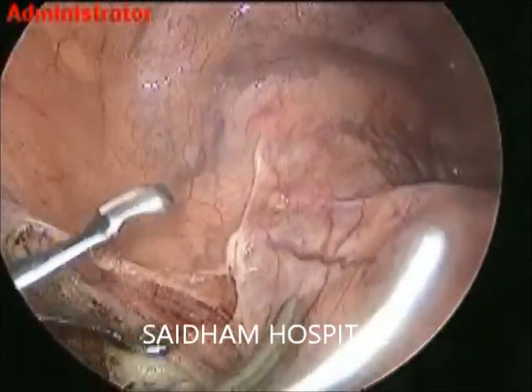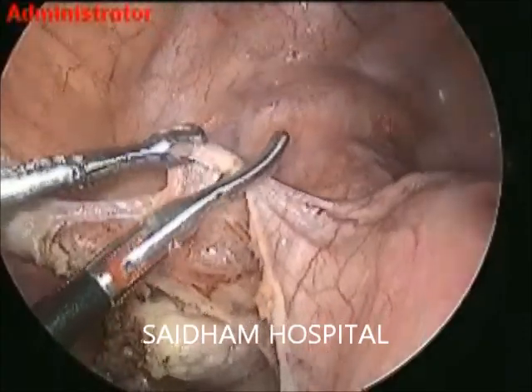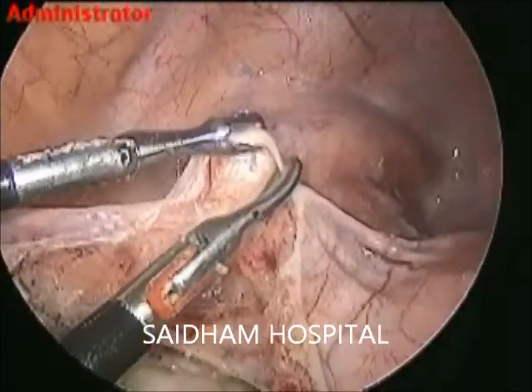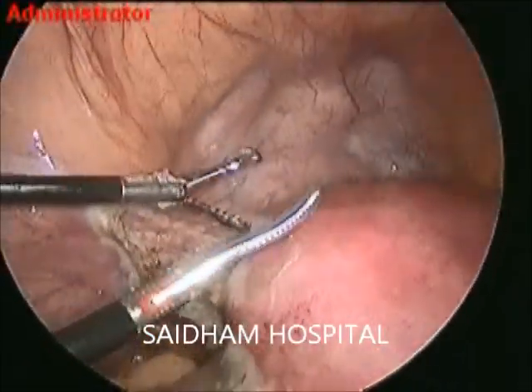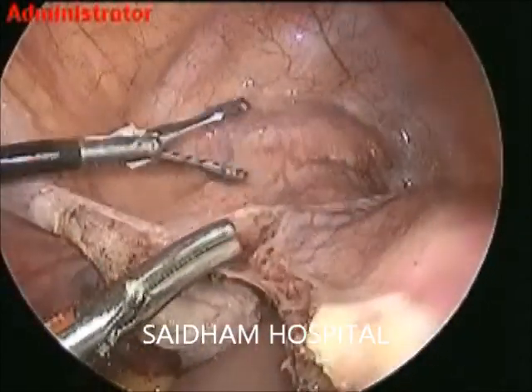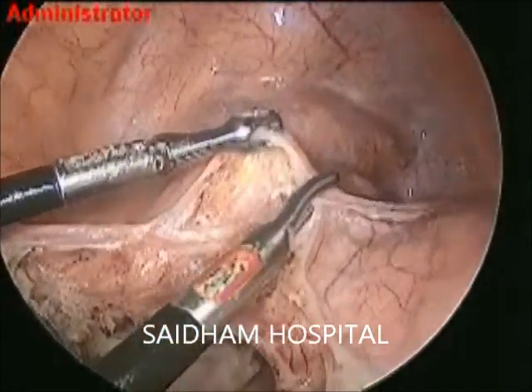I have given a nick in the middle and just lift. Lift, stretch, and cut is the principle here. Good lifting will allow gas to enter in. Stretch is the basic principle of cutting in bipolar. Traction and counter-traction — I have already discussed these things in my many previous videos.